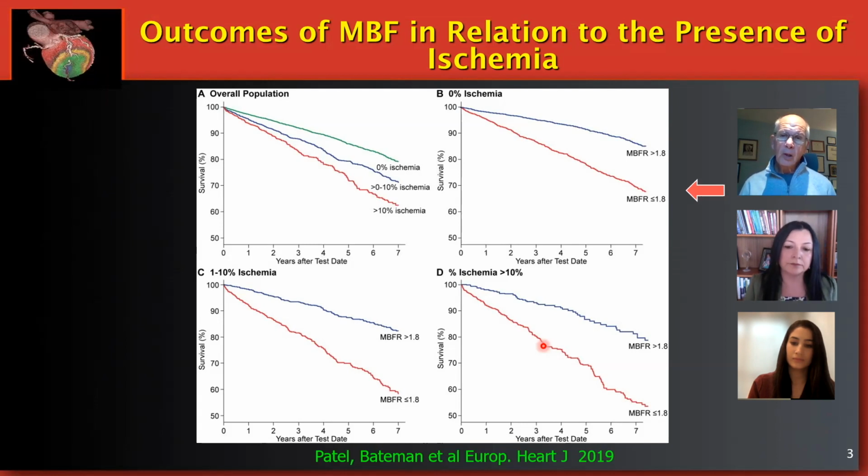And so what I work with the technologist on is let the patient relax. Make sure you're starting with a normal heart rate and a normal blood pressure, then put them under the camera. When you do that, the number of abnormally high resting flows is much lower. So it's a long-winded response. I think it takes some real thought, and I really rely upon the stress data to help guide me as to whether the whole blood flow response is abnormal.